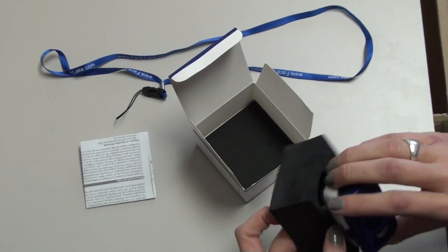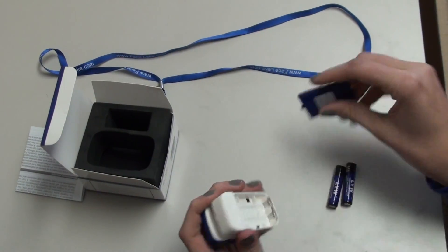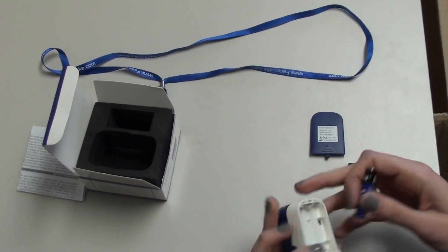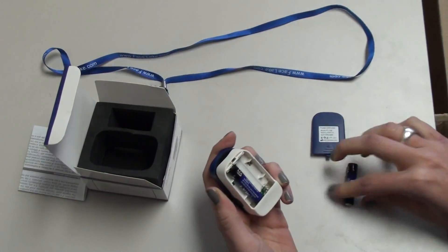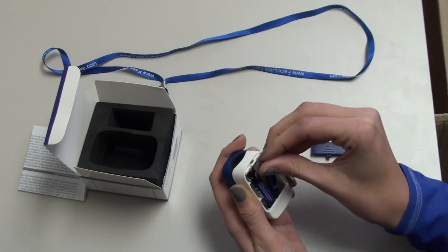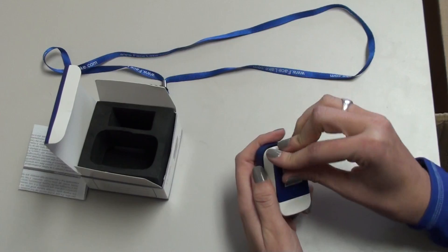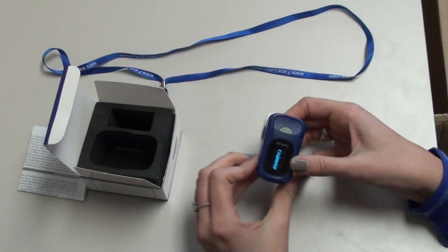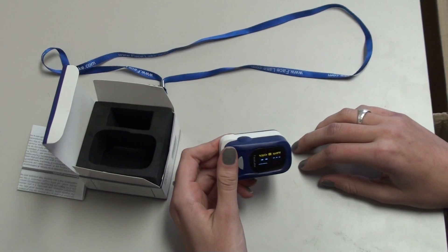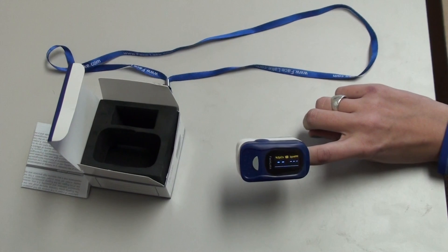We're going to start by simply putting in the batteries so we can begin monitoring our oxygen levels and pulse rate. Once we have that, we're just going to turn it on, and you're going to put your index finger in with your nail facing up.